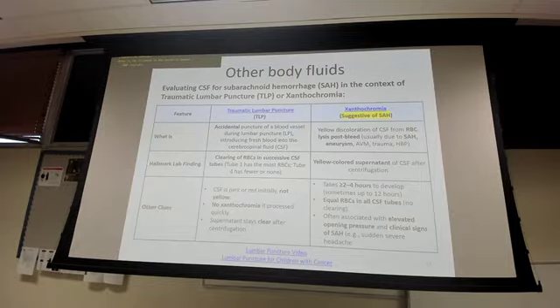But in SAH, you'll see that yellow colored or even that light pink colored discoloration amongst all 4 of the tubes. And so we're suspecting some type of hemorrhage going on with your patient. Also, when we look at it under the microscope, we don't see those intact RBCs. It's just kind of a pinkish, reddish look underneath the microscope, okay? Yep, know that slide, okay?